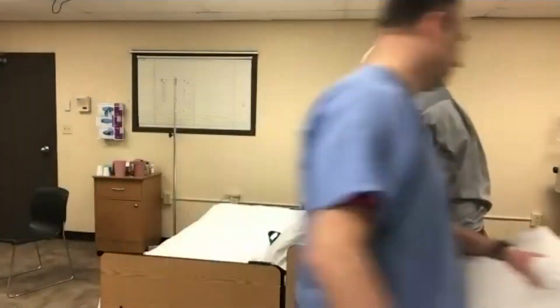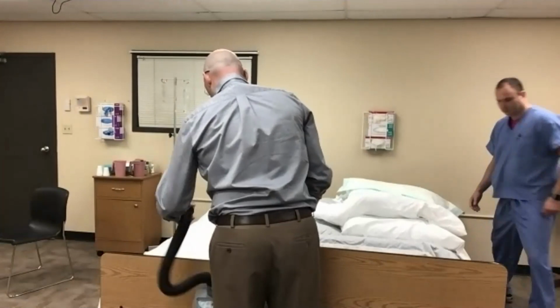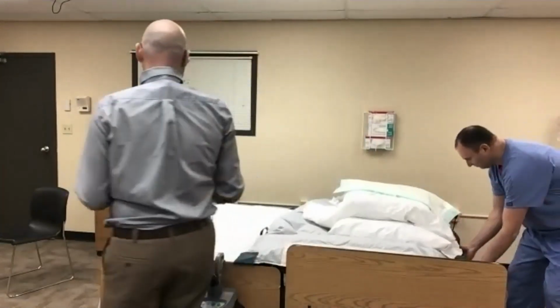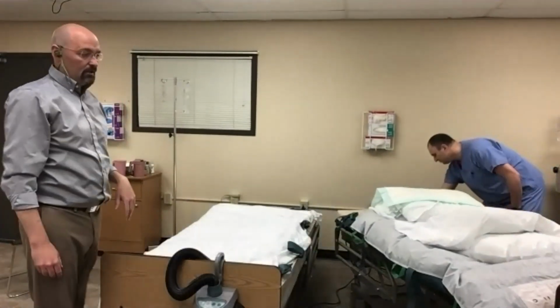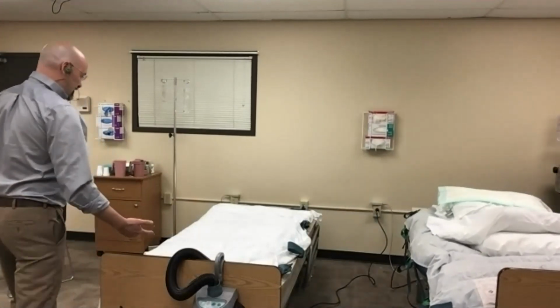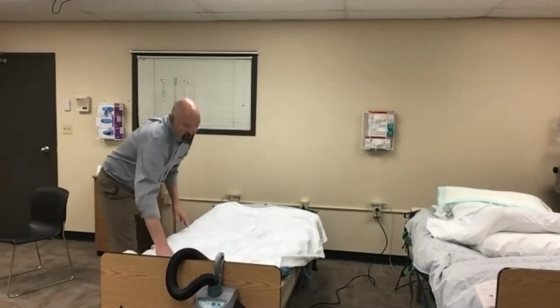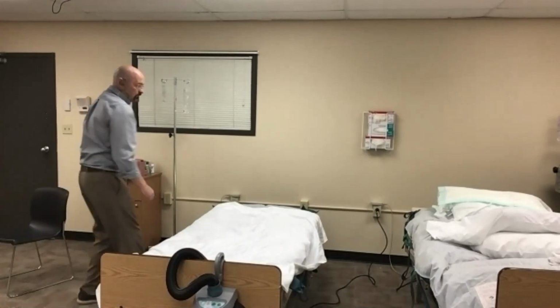So let's say we don't have enough space in our ICU, or we're using a med-surg room, or any number of different factors. We're now going to show you how you can pronate a patient on a single surface using a HoverMatt or an air transfer device. What we found is the best and safest way possible. So we're going to get our friend again.